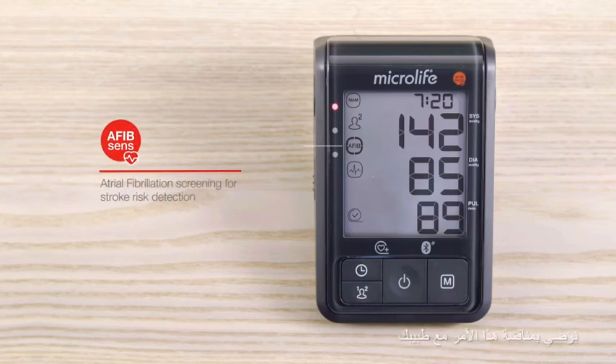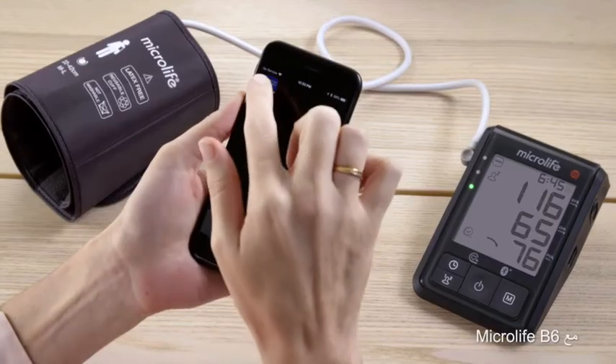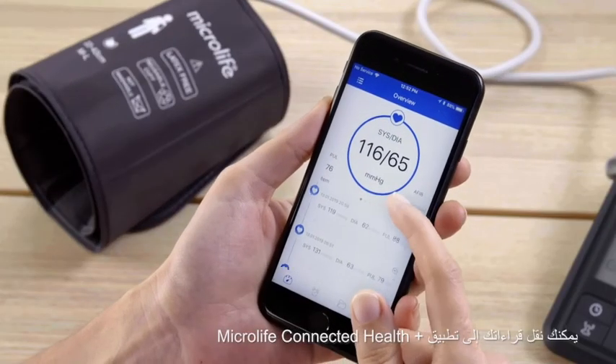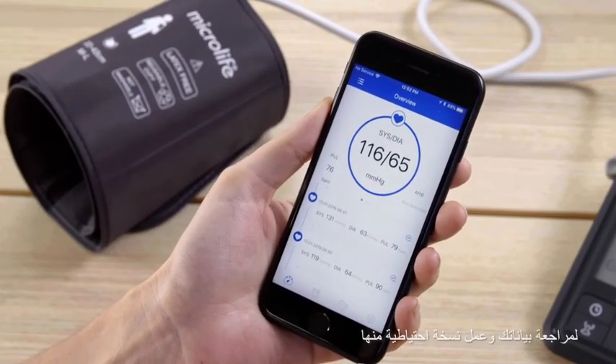We recommend that you discuss this with your doctor in order to lower your stroke risk. With the Microlife B6, you can transfer your readings to the Microlife Connected Health Plus app to review and backup your data.